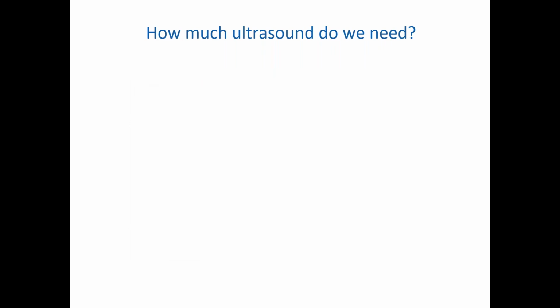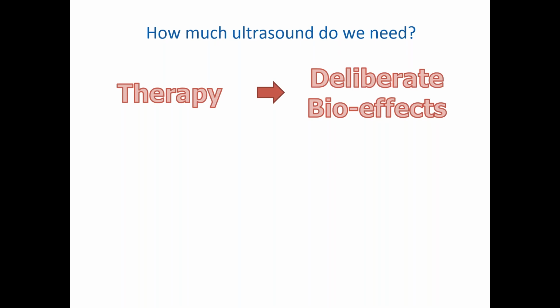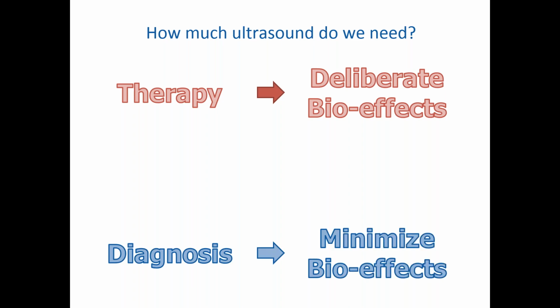So clearly then we can ask the question, just how much ultrasound do we need? In a therapeutic situation, we're looking to cause deliberate bioeffects. However, if we're looking at a diagnostic situation, then we're trying to minimize bioeffects. And at that point, it needs to be realized that there's a threshold somewhere between the two. Depending on whether we're looking to undertake a therapy or whether we're just looking to diagnose something from the tissue, we can set some kind of threshold level. Exactly what that threshold level is and where it is often not the responsibility of the experimenter, but we'll go on to talk about who may be looking at the regulations in that area.